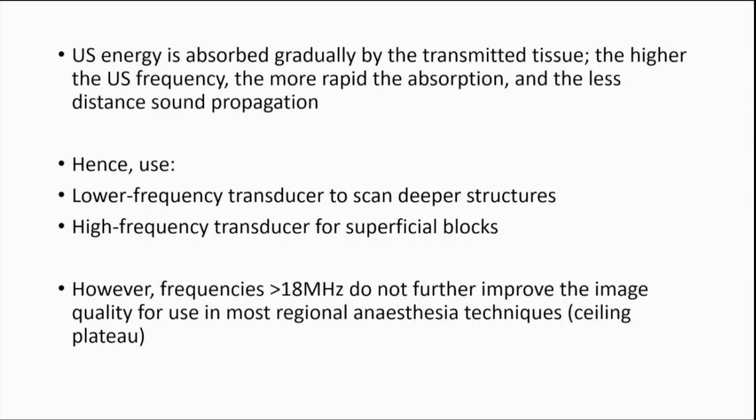However, as the ultrasound waves travel through the tissue medium, some of it may be thermally absorbed or attenuated. And the higher the ultrasound frequency, the more rapid will be the absorption. So the less distance sound propagation there will be. So the general rule is to use a lower frequency transducer to scan deeper structures, and a high-frequency transducer for superficial structures.